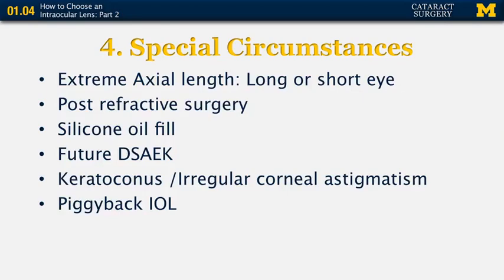And there we can make certain adjustments. Other special features to consider are if the eye has silicone oil, do we anticipate a silicone oil removal? If not, we might want to choose a PMMA IOL rather than a silicone IOL. And then there's, of course, other features as far as the index of refraction that also are quite important for a silicone oil-filled eye.